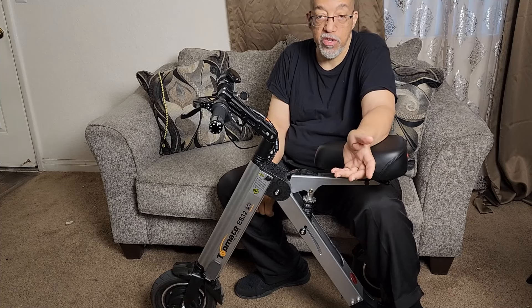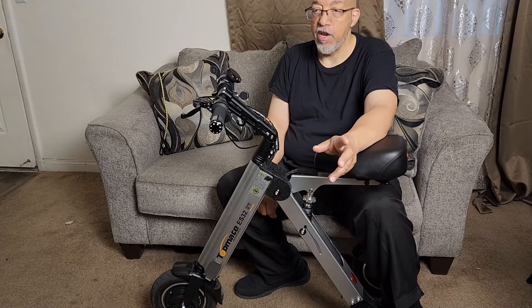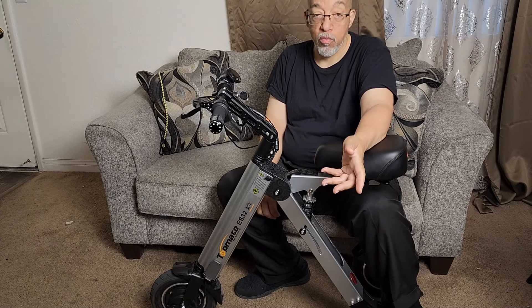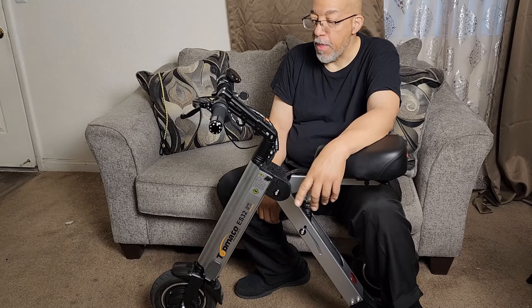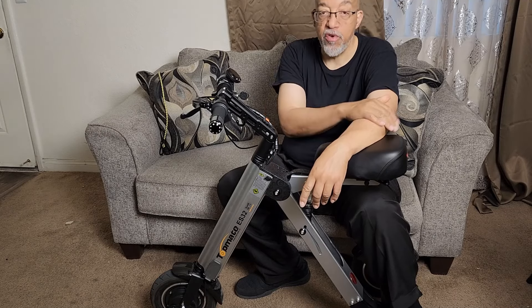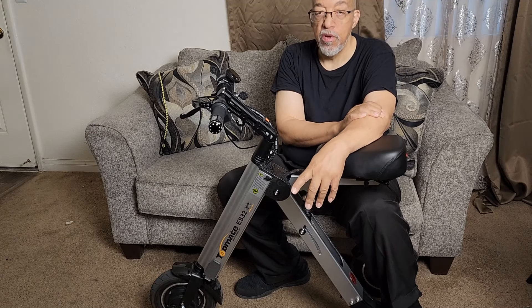I actually just charged it once because it was down to half. I use it on the bus, ride it around the grocery store, and around work when they let me — don't tell the boss! But like I said, it's a fun and also useful tool, especially if you have any mobility issues. Topmate ES32 Electronic Mobility Scooter.